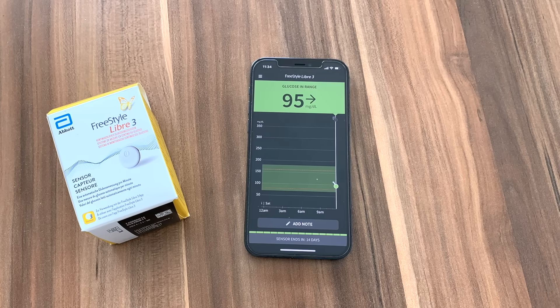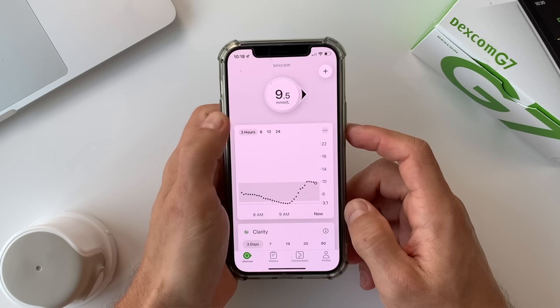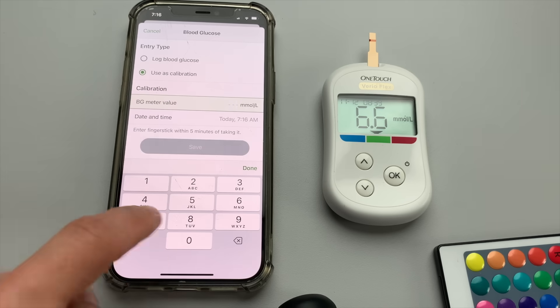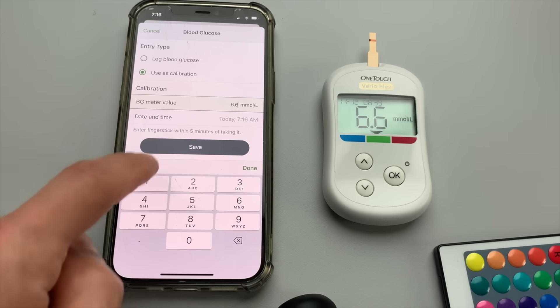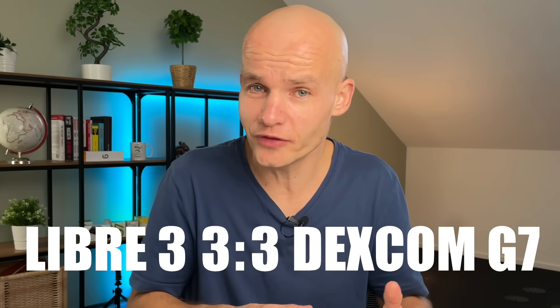One thing to note is that the glucose value on Libre 3 updates every minute, while Dexcom G7 only updates every 5 minutes. So you could say Freestyle Libre 3 is a little more real-time, but from my real-life experience you don't really see that big of a difference. Another thing to consider is the ability to calibrate sensor readings in the app — this can only be done with Dexcom G7, as Freestyle Libre 3 doesn't have a calibration feature. Overall I'm going to make this a tie — one point to each sensor for accuracy.